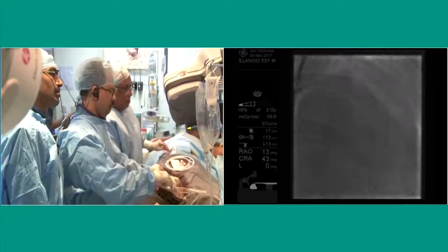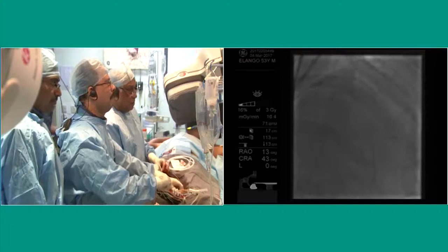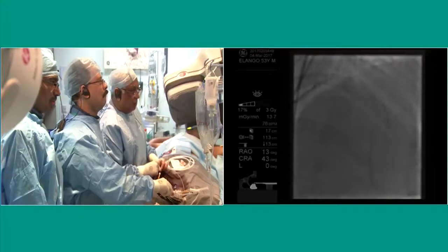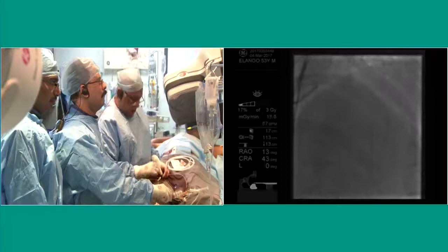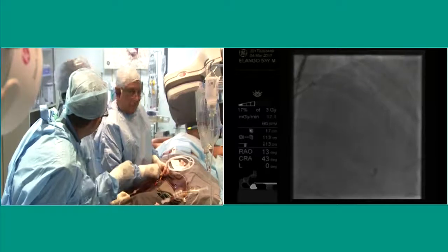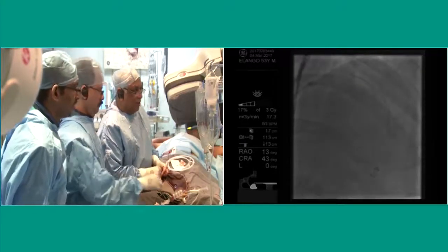Actually, this brings true the fact that yes, we need a variety of new generation, third generation stents when we do complex lesions. And the real problem is going to happen not now. 6 months later, we perhaps won't have any of the new low profile, slick, trackable devices. And that's going to be a challenge when we face heavily calcified bifurcations, and so on and so forth.